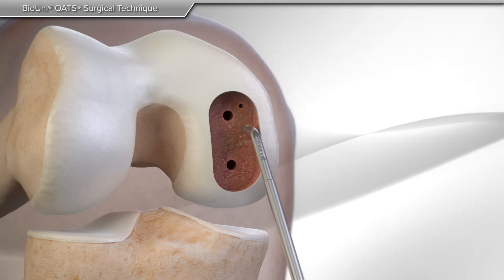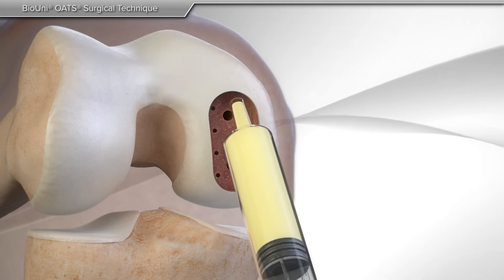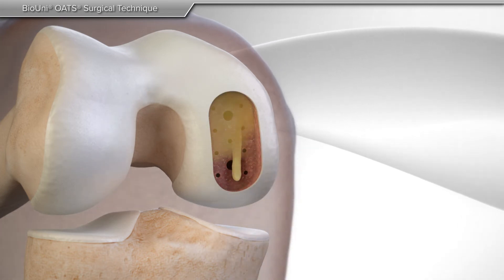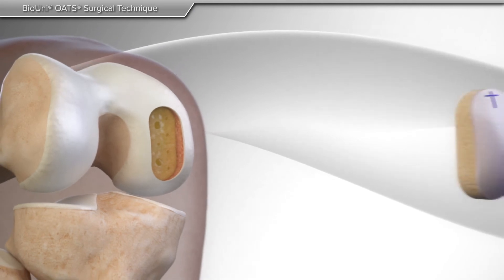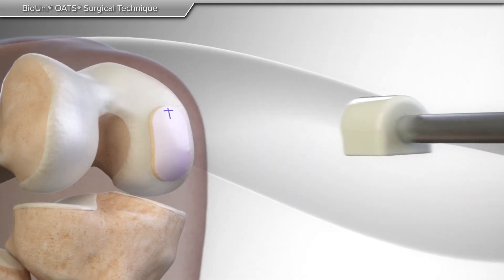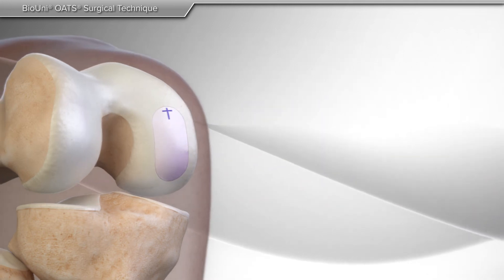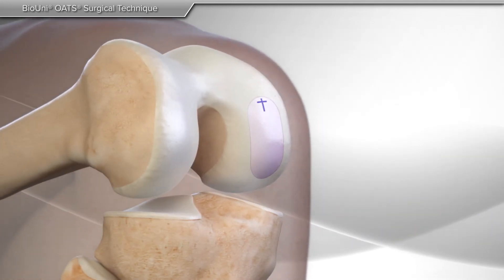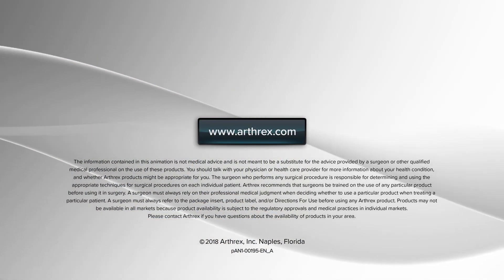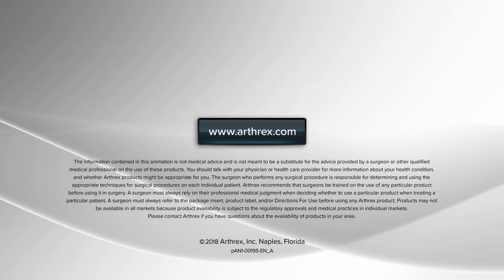Your surgeon will stimulate the area to promote the natural healing response between your knee and the allograft. Finally, implanting the allograft to restore the bone and cartilage.